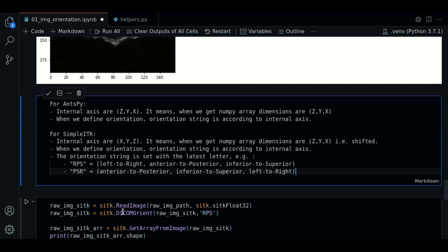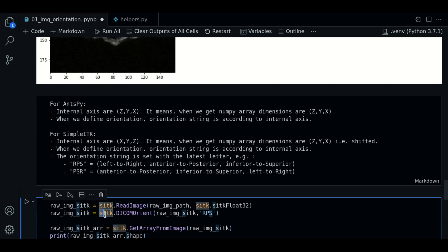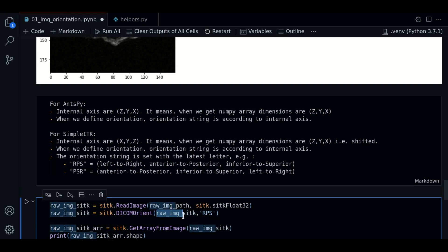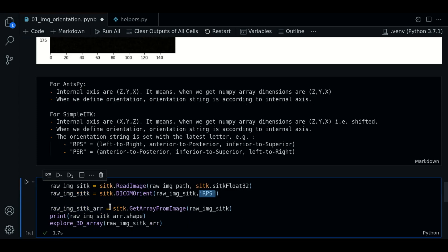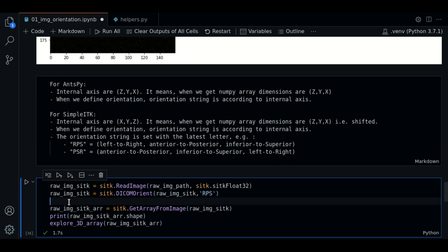Now, let's use this. The function we use to define the orientation is SITK.dicomOrient. We pass the image and the orientation string.